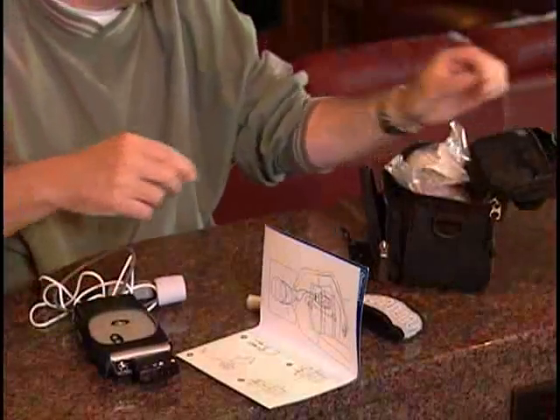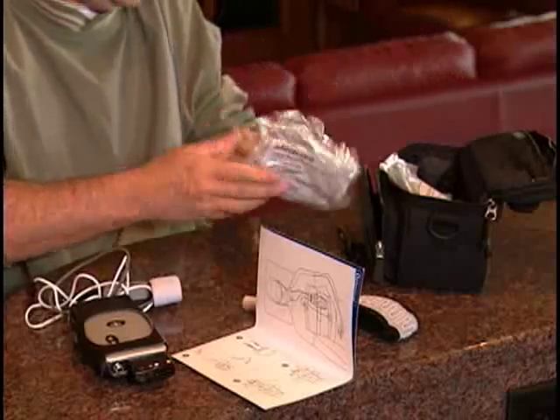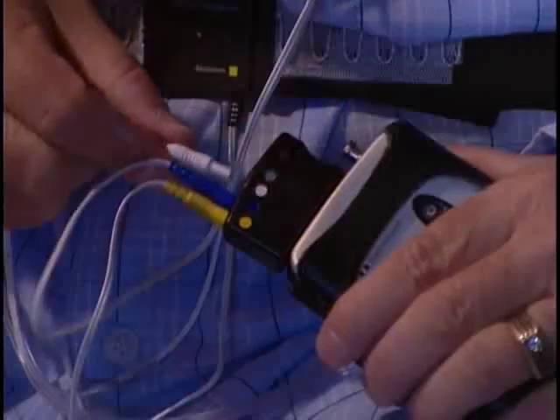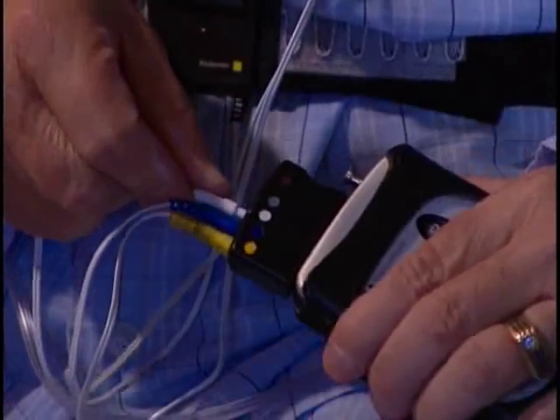If your clinician has supplied you with a snore sensor, the side with the small raised bump should be placed directly on your skin. Locate your Adam's apple and position the snore sensor to one side of it. Use the medical tape to secure the sensor in place. The snore sensor is plugged into the white sensor input on the proxy.